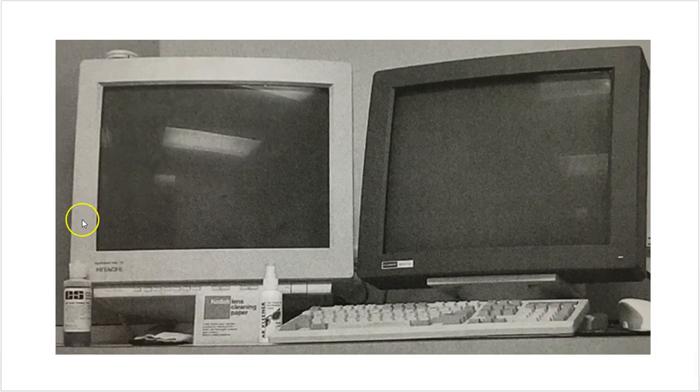That's specular, right? Now diffuse, you see here how two-thirds of the monitor have no light reflecting on it, and then in this last third, you've got light randomly scattered across the screen. Well, that would be diffuse reflection. Specular reflection, diffuse reflection.